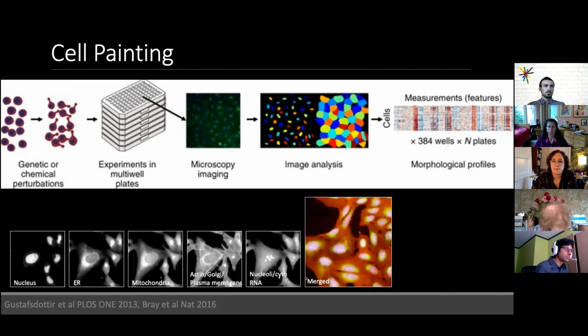And so this microscopy data can then be automatically acquired using a slide scanning microscope and then analyzed using open source pipelines that this group also developed, that may incorporate machine learning to measure the morphological features of cells in this unbiased way. And so this has the potential to reveal phenotypes or biomarkers that might otherwise not have been identifiable by eye, even by a highly specialized pathologist.